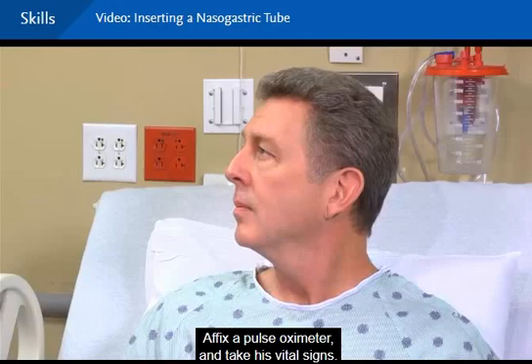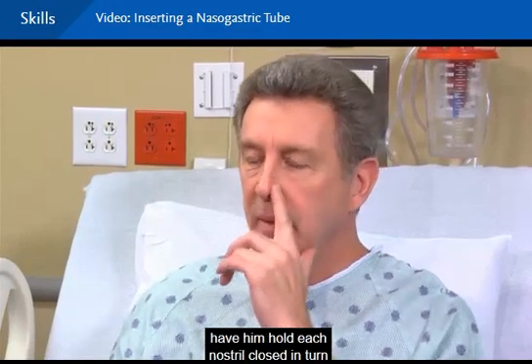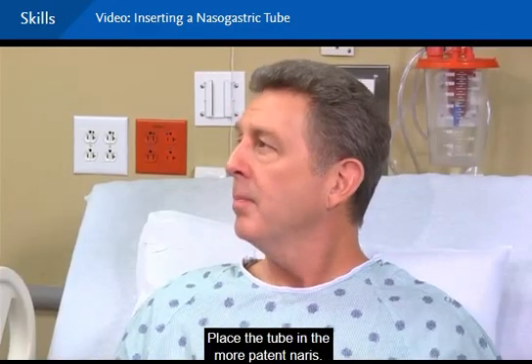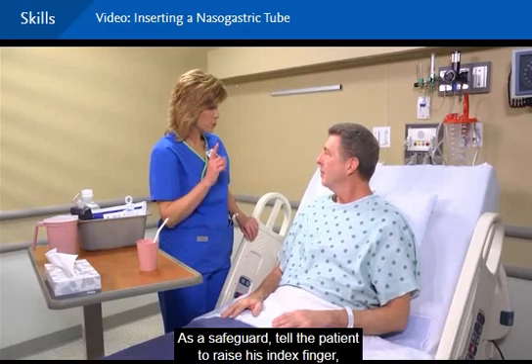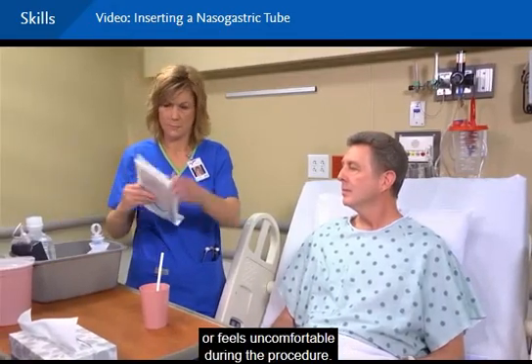And then I want you to close each nostril and blow. To assess the patency of the patient's nares, have him hold each nostril closed in turn while breathing through the other. Assist him if needed. Place the tube in the more patent nares. As a safeguard, tell the patient to raise his index finger, if necessary, to let you know if he's gagging or feels uncomfortable during the procedure.